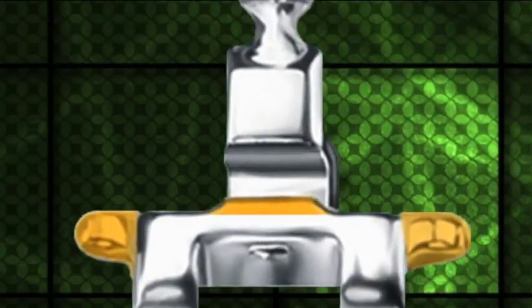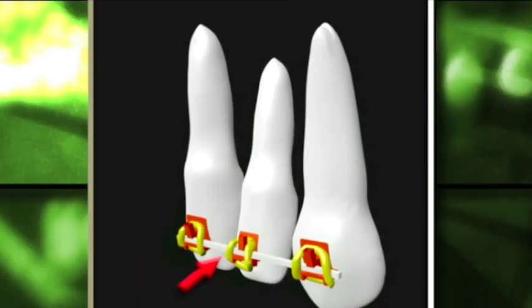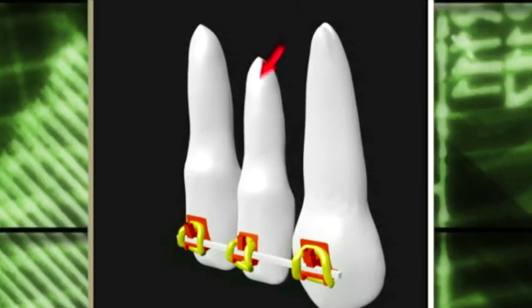The squared shape main arch wire slot with the specially designed super elastic square wire helps torque the root from the beginning of treatment.